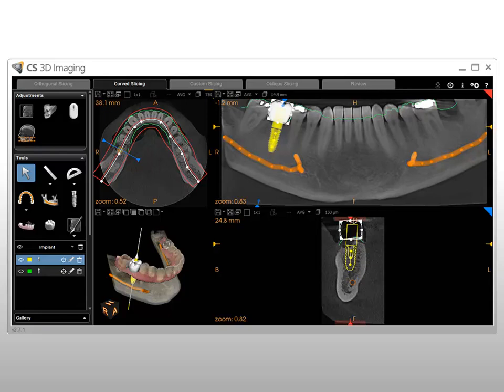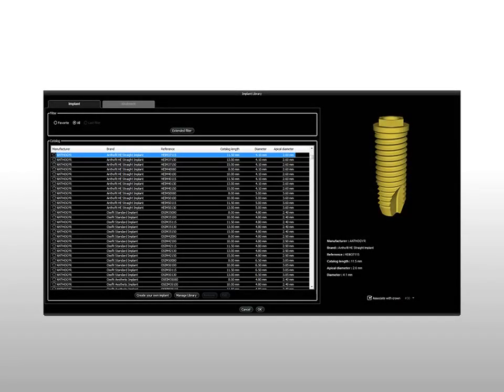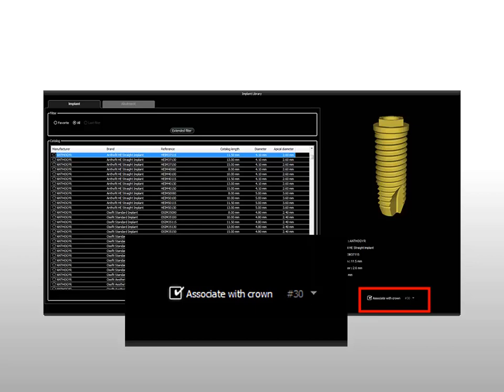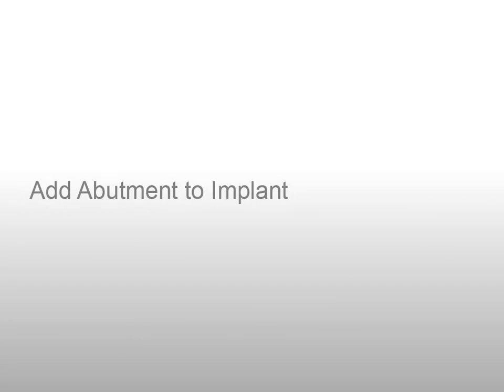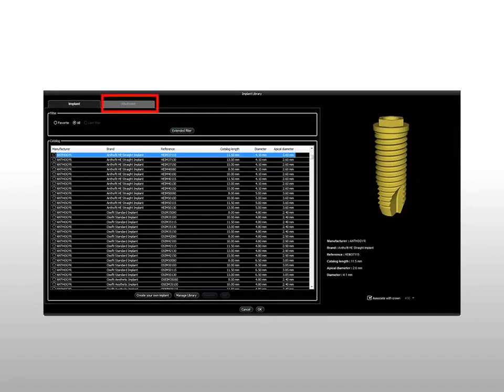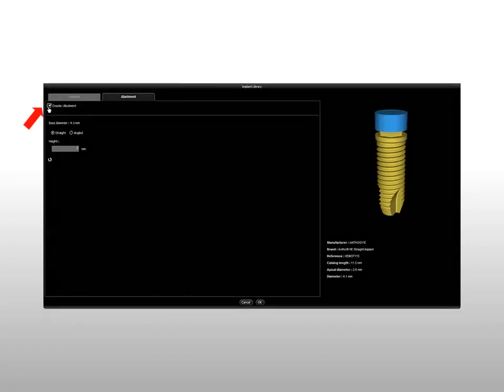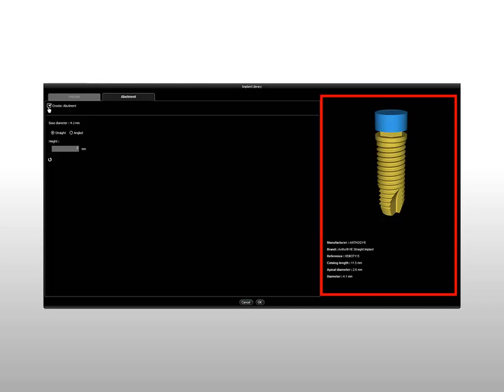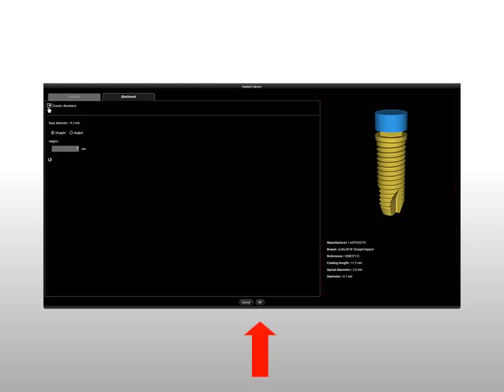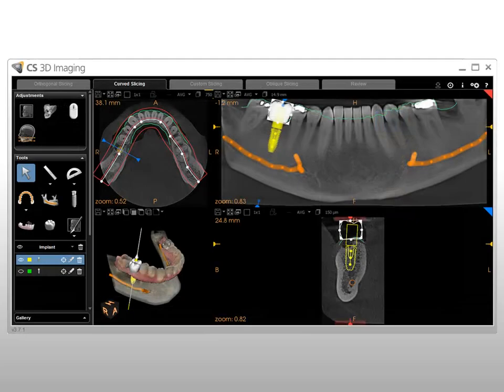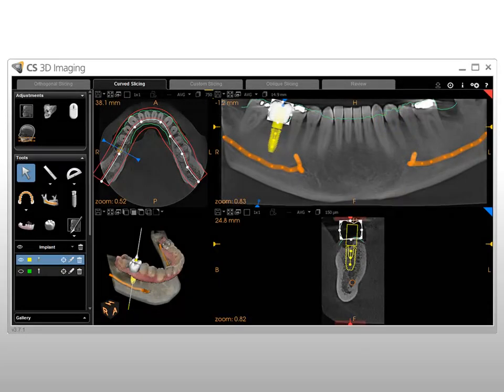Select the implant. To associate an implant with a crown, select a crown number from the Associate with Crown drop-down list, then select the Associate with Crown option. To create an abutment to associate with the implant, on the Implant Library's abutment tab, select Create an Abutment and enter the abutment parameters. The implant and abutment are displayed in 3D and relevant implant reference information is displayed. Click OK. The implant with the abutment are imported into the volume based on the position of the crown, and are visible in all views of the Curve Slicing tab.